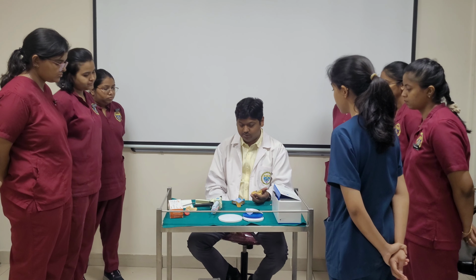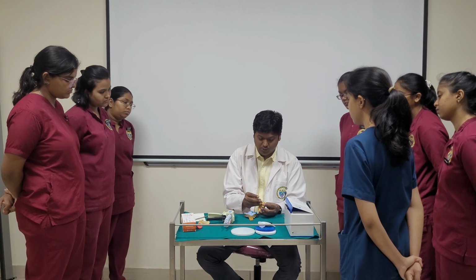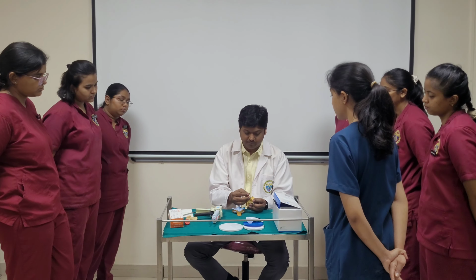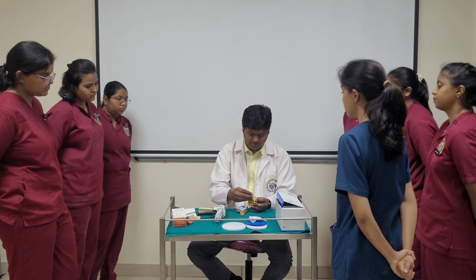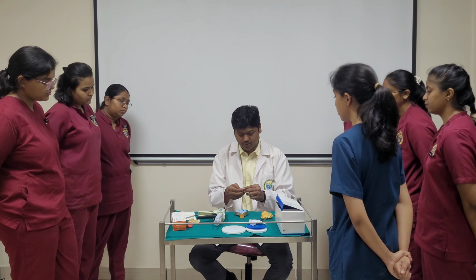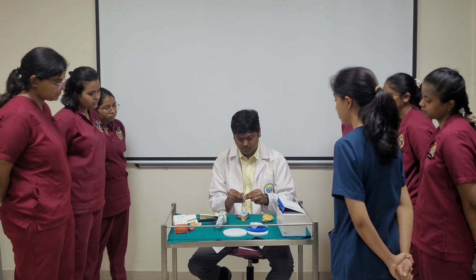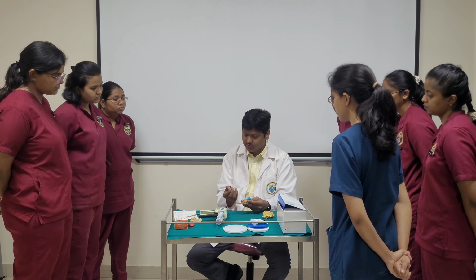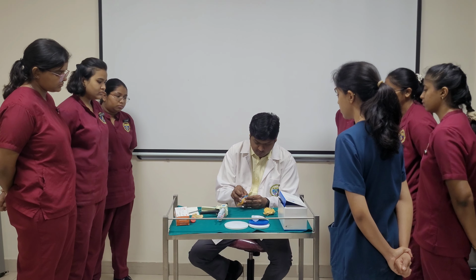Your transfer coping is still inside the patient's mouth. As I told you, you manually need to transfer it. Unscrew it. And in the impression, you can see there is a flat surface and a curved surface. So the same direction you need to place it back.